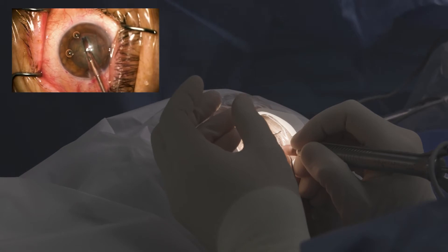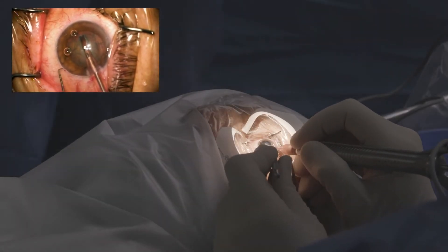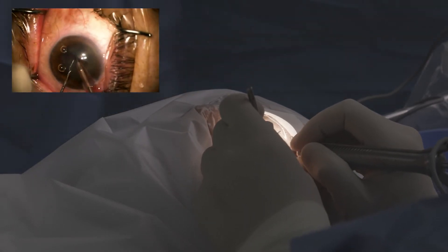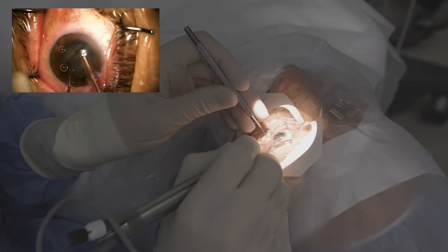I'll take the chopper. So with this, you can still get a little bit of that chamber shallowing, but that lens is held back much better.